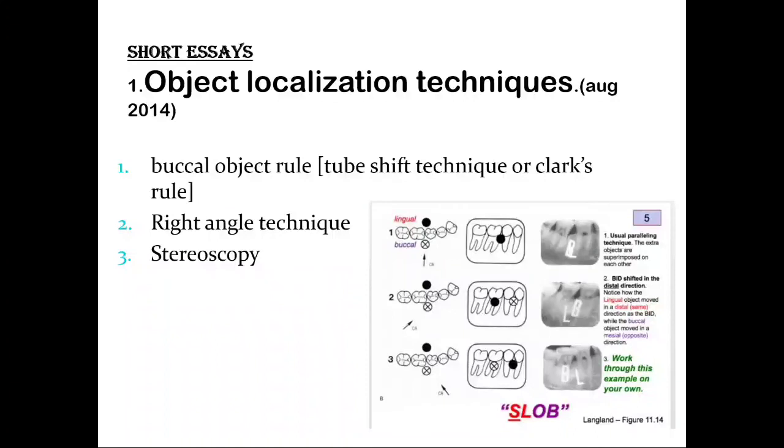After processing, the films are viewed with a stereoscope, used with either mirrors or prisms, so as to coordinate the accommodation and convergence of the viewer's eyes, so that the brain can fuse the two images together. Then you can assess, in cases of the mandible, the mandibular canal in relation to the roots of the unerupted mandibular third molars. Even bone shape can be assessed when placement of a dental implant is being considered under this technique.